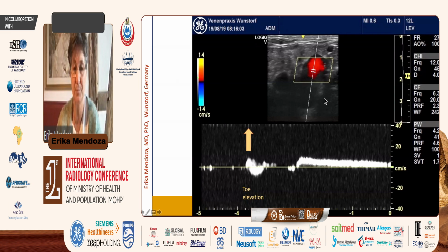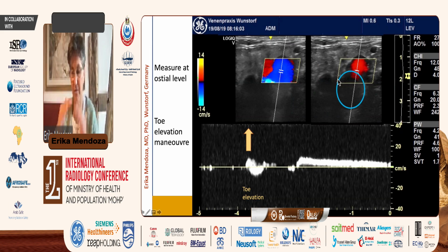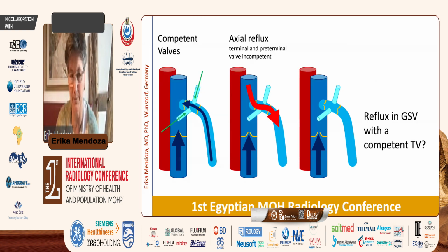This is the reflux curve. Here goes the toe elevation, then the toe relaxation. In the elevation, we have an inflow. In the relaxation, we have an outflow. And we measure this at the very point of the ostium, at the very point where the saphenous vein enters the deep vein, to be sure that the terminal valve is the one incompetent.